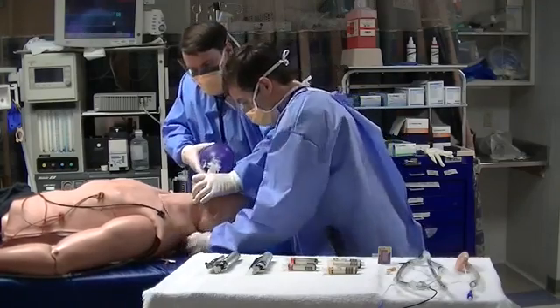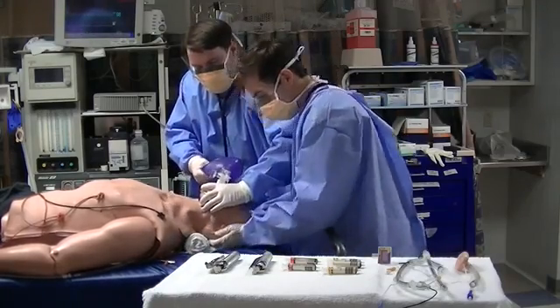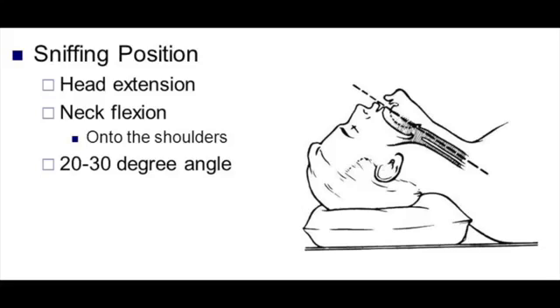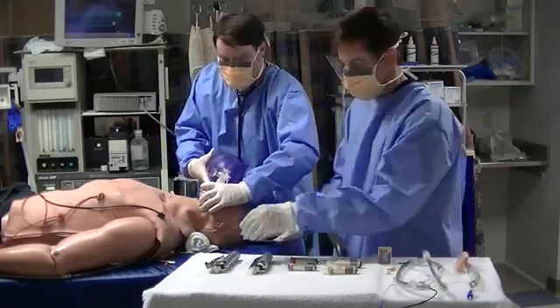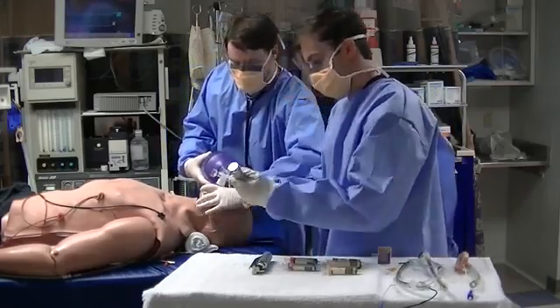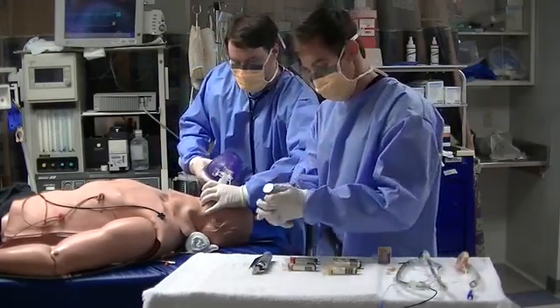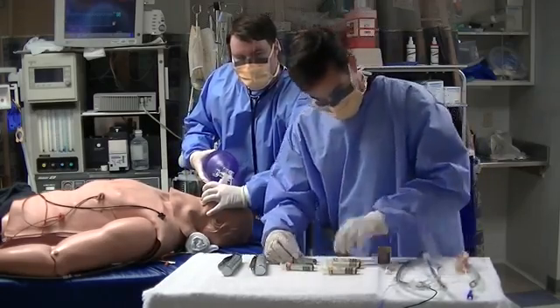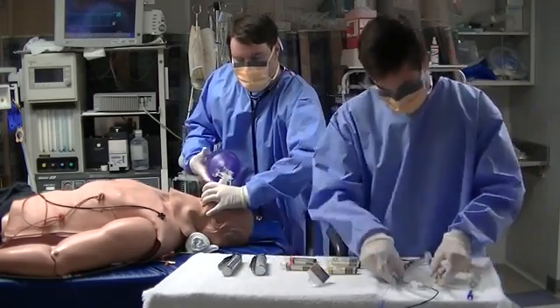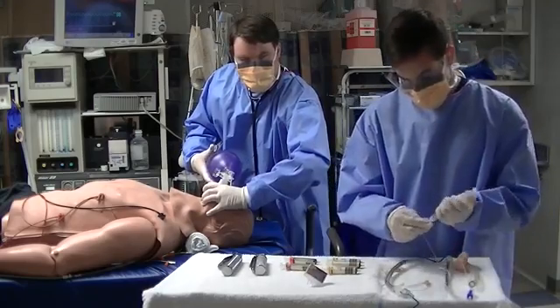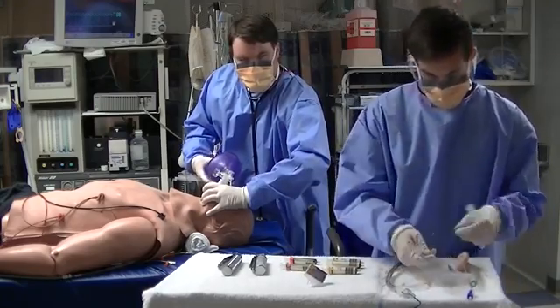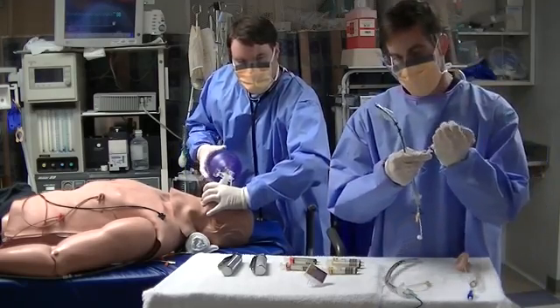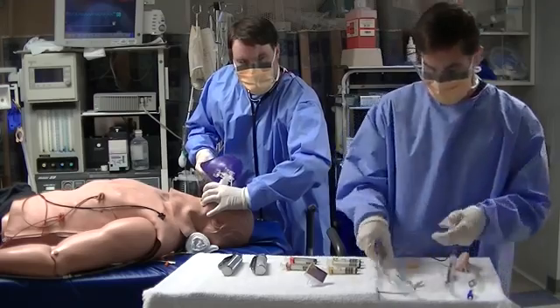Note how the provider uses a rolled-up towel to place the head in the sniffing position, which helps minimize airway resistance and get a better look at the vocal cords. The provider then checks his laryngoscope blades to make sure the light source is working adequately, and he has not just one but a backup blade as well. He then checks both endotracheal tubes and inflates the cuff of both tubes to ensure his equipment is functioning properly.